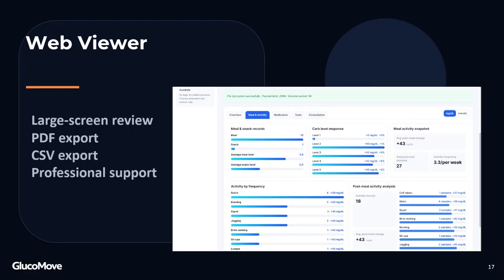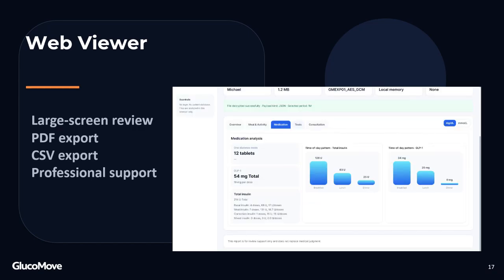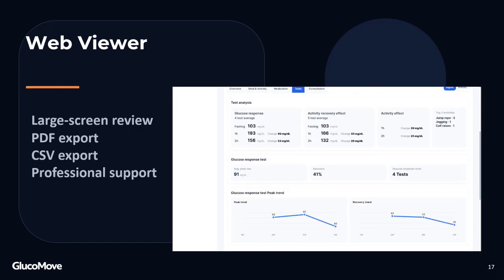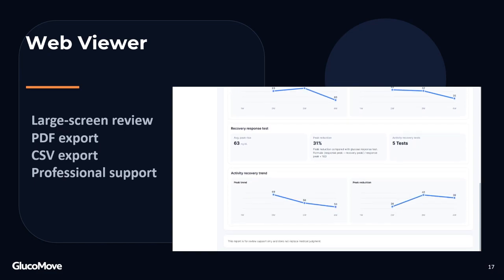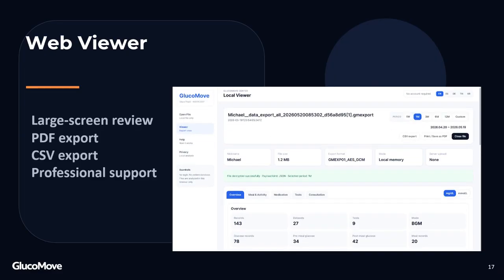Professionals who wish to use the web viewer can submit a request form through the contact page on the GlucoMove website. To help support better glucose management for app users, GlucoMove currently provides web viewer access free of charge for approved professional use cases.